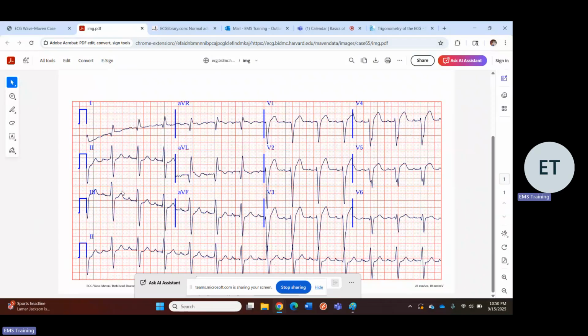Now let's look at the axis. Thumb up, thumb midway. So it's not thumb up, thumb down. So this would be more of a left axis, because of your left thumb, but not totally left axis. So this axis is weird.